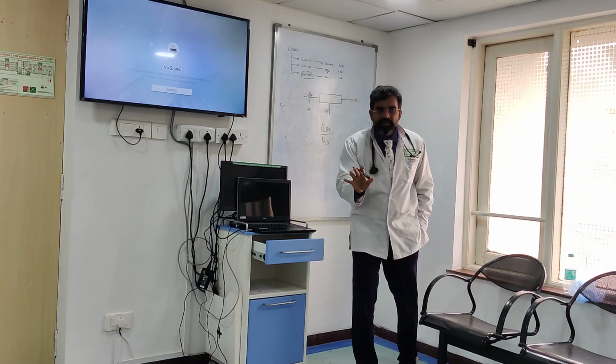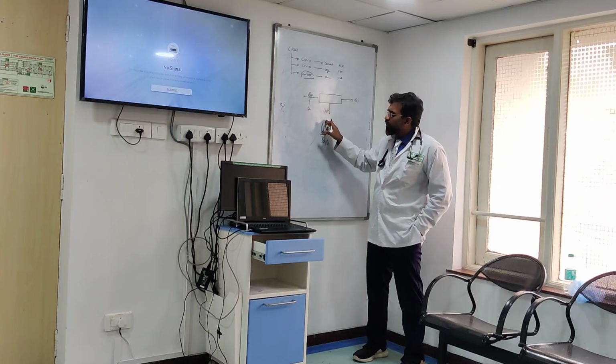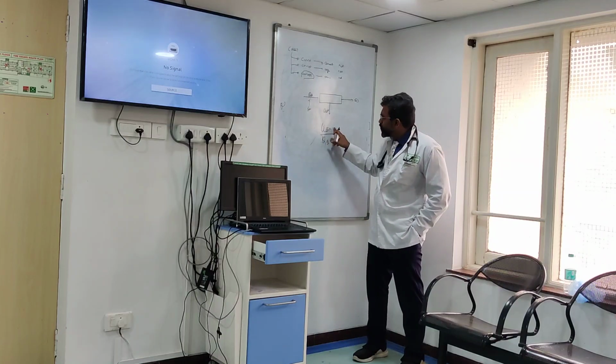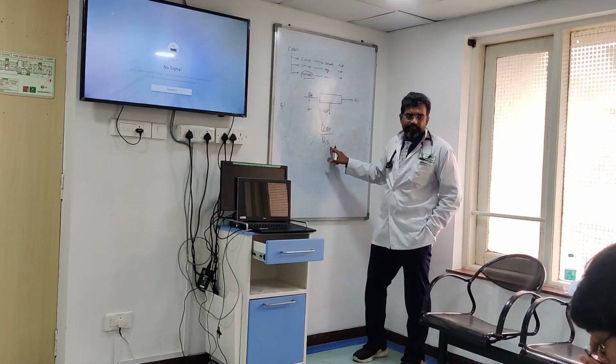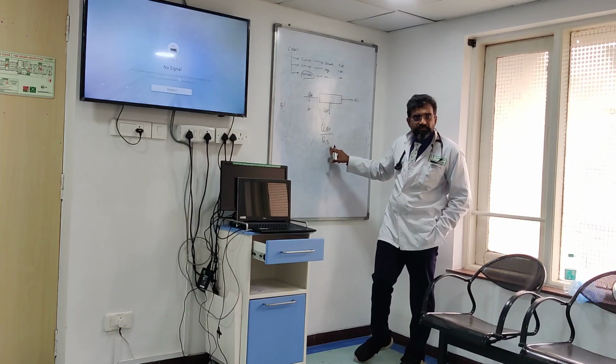Right? समझ में आ रहा है? Since I know that at 24 hours, my urea going from here and urea coming here is the same, I can actually just equate this equation as QEF upon QB. समझ में आ रहा है? Effluent upon blood. Clear? Understood this much?